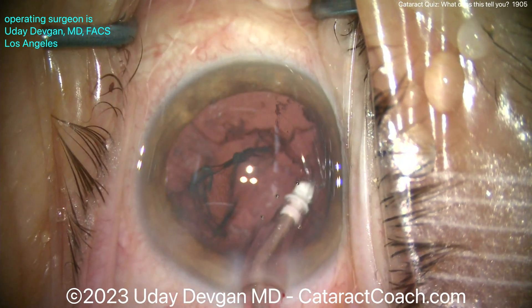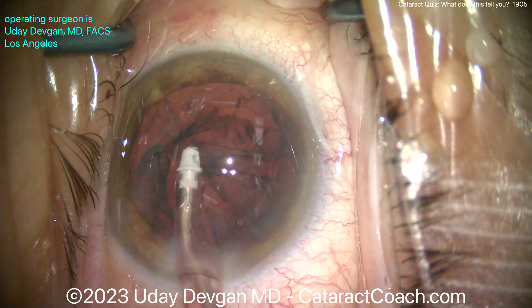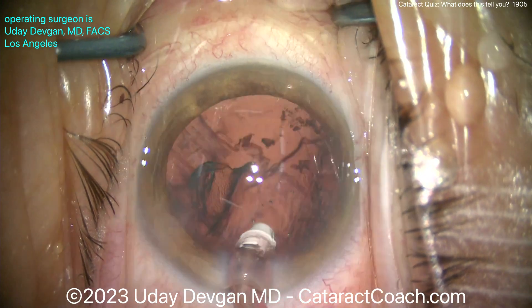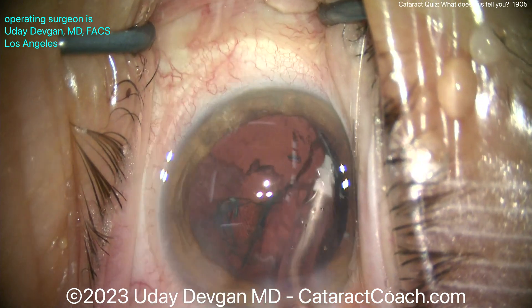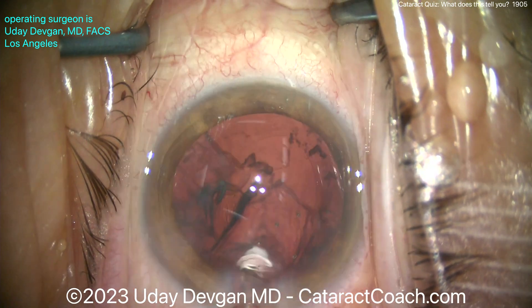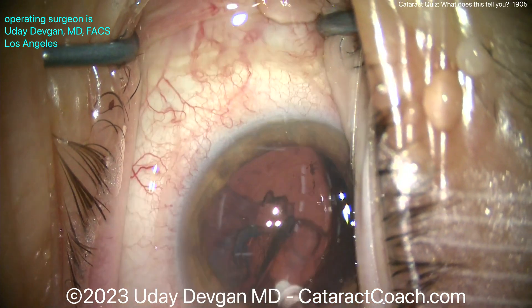Let's be very cautious here. You need to be extra cautious in the area of zonular loss because you can zip and break more zonules — just like when you pull on it, it'll detach even more. Right now it's a small defect, maybe two or three clock hours. You can make it six, eight, or ten clock hours if you're not careful.